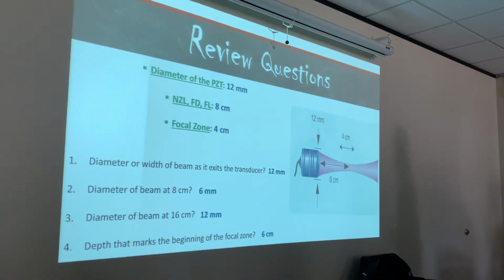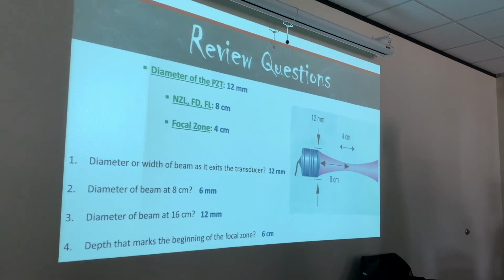So basically we come from the focus to this part. Absolutely, because I'm asking you what marks the beginning of the focal zone. Okay? What depth marks the end of the focal zone?